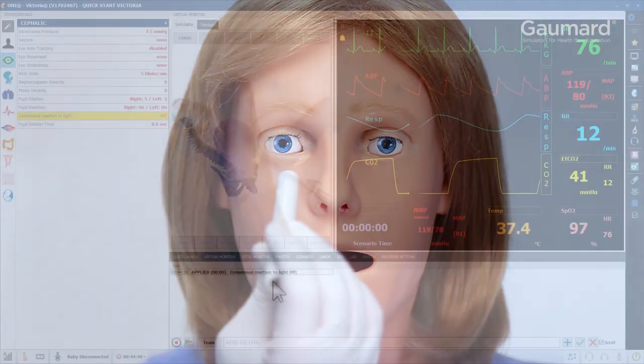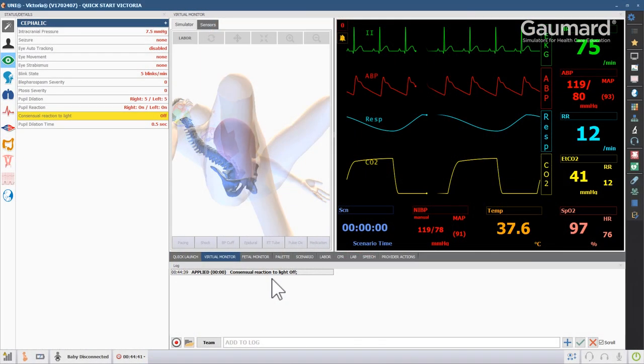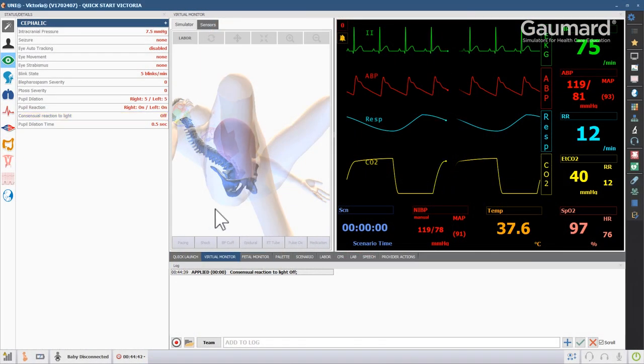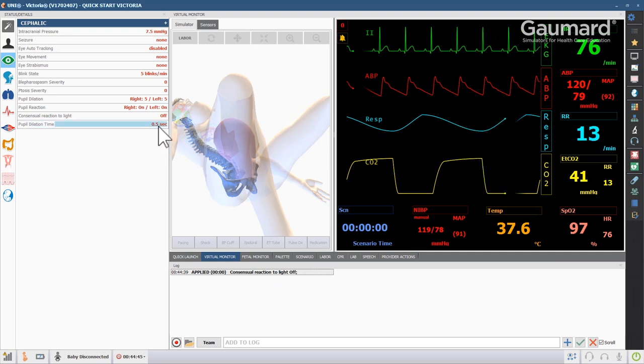You can also change the amount of time it takes the pupils to dilate after reacting to light stimuli by changing the pupil dilation time.